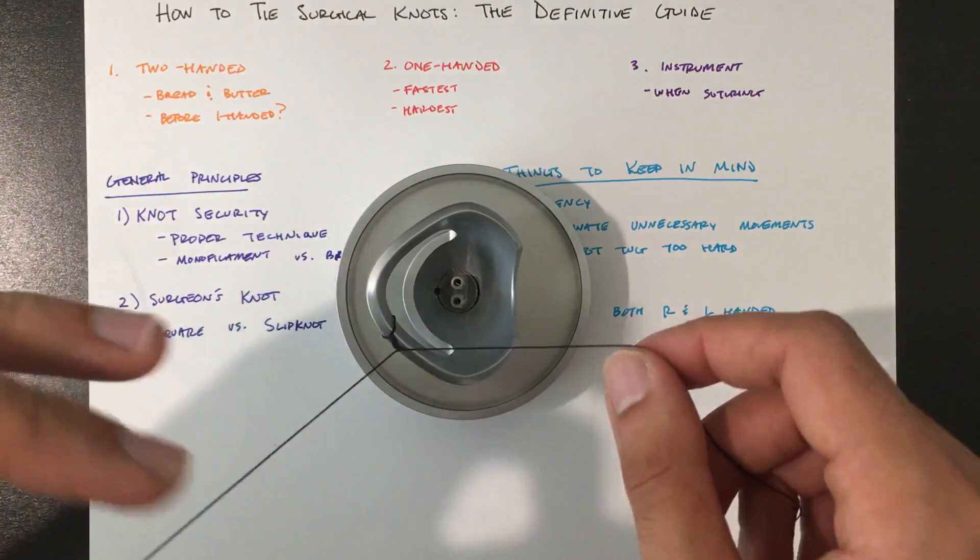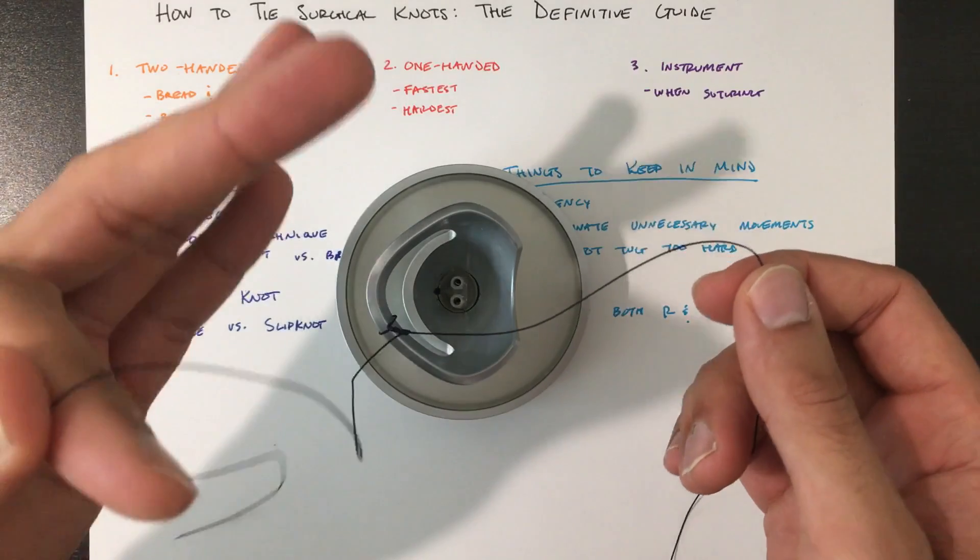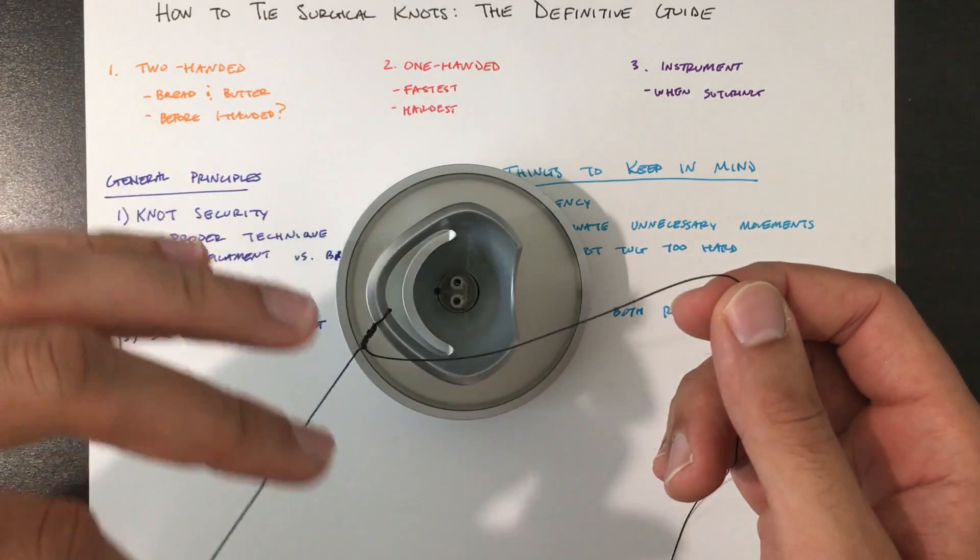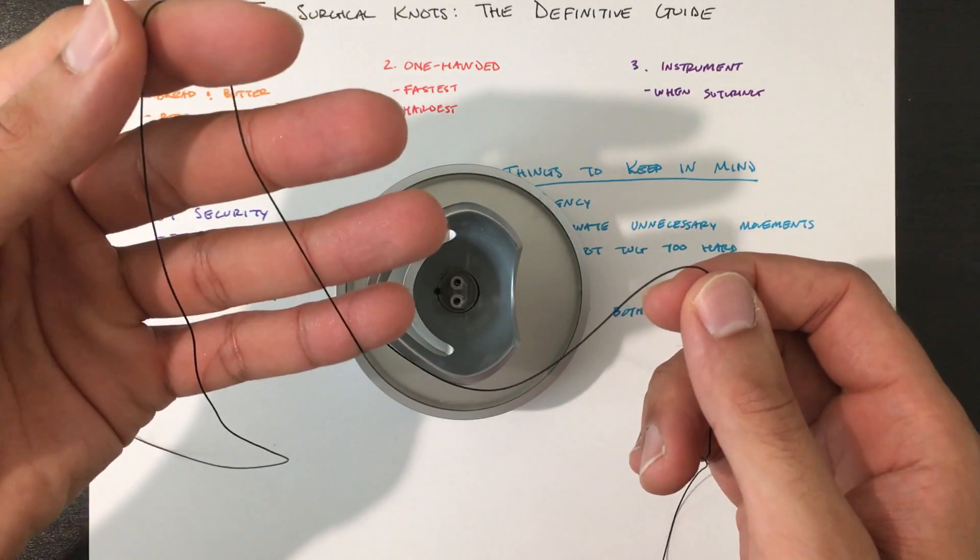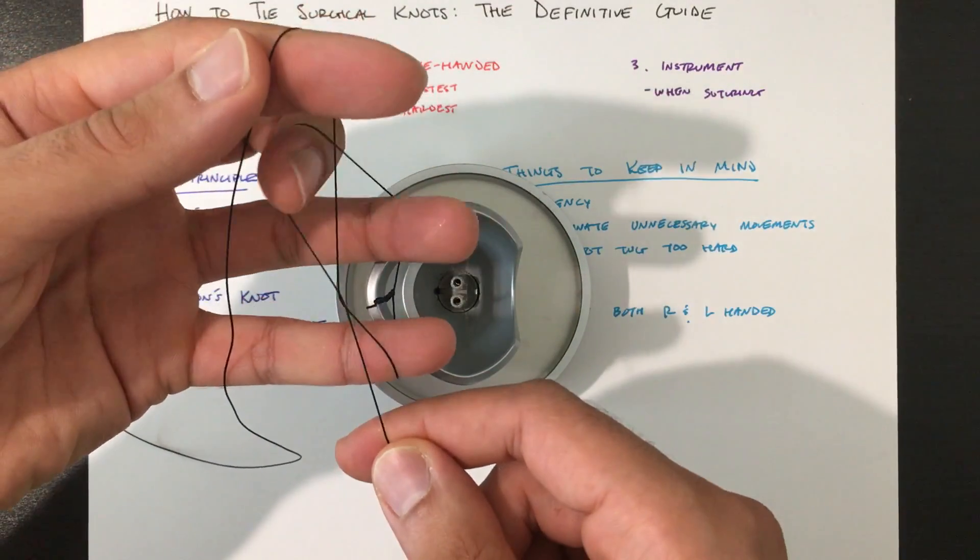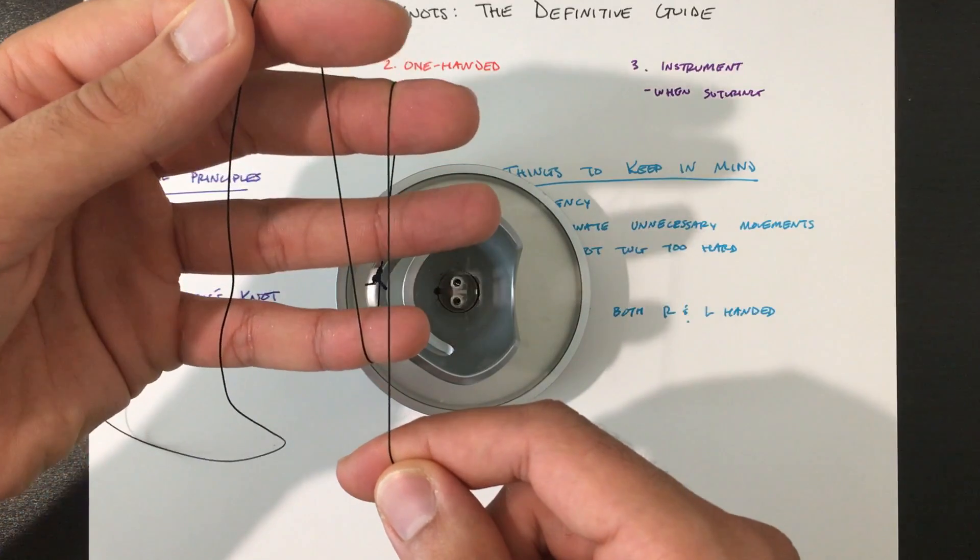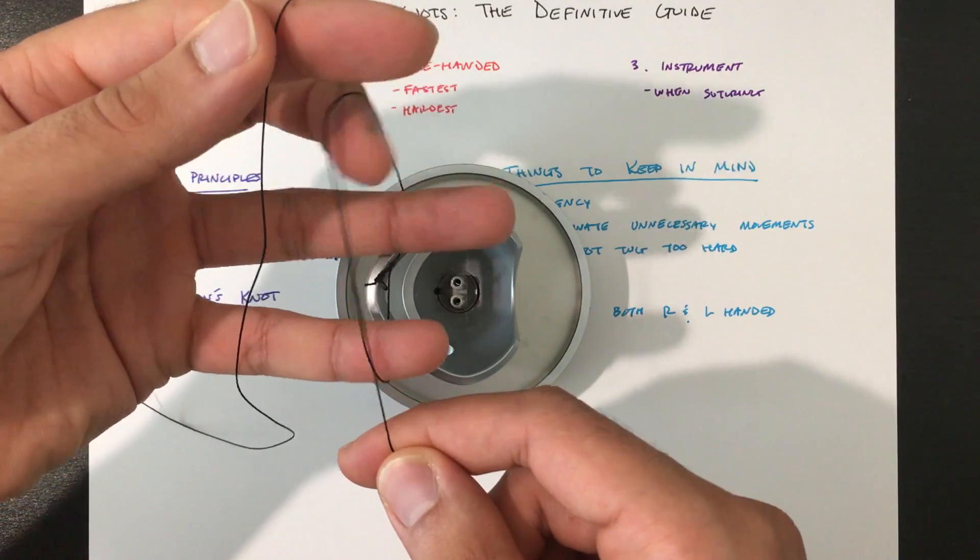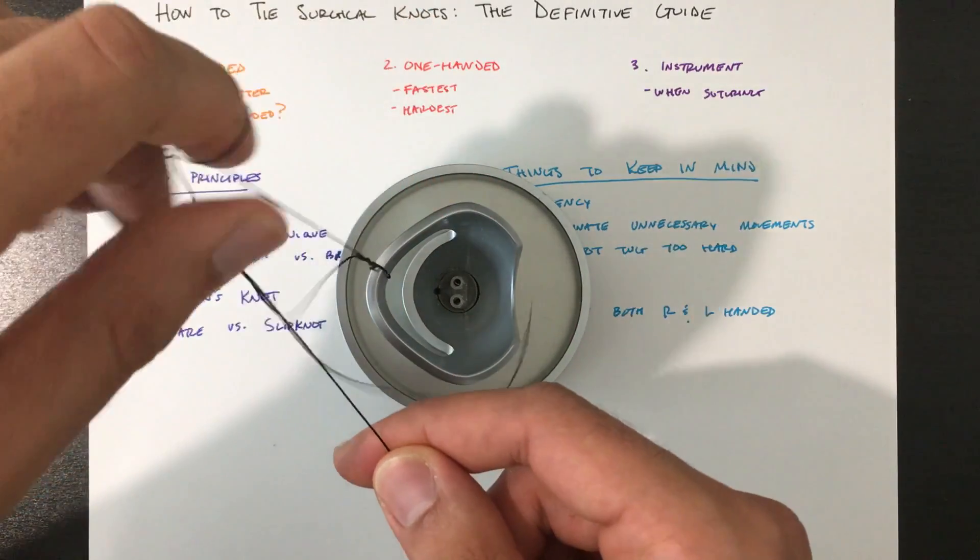Now let's do the left side. So same exact thing. Index finger. Three fingers behind. Take the other side. Put it in the opposite direction. And again using your middle finger to grab the first side, bring it through.